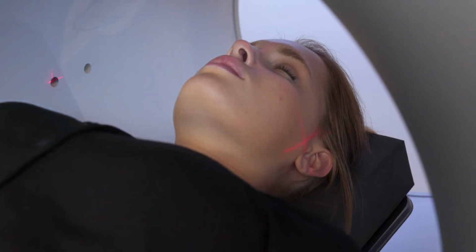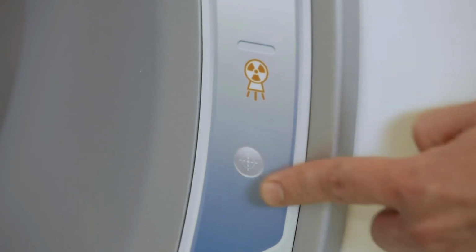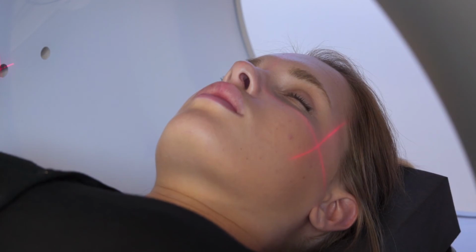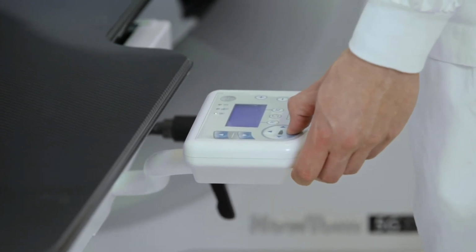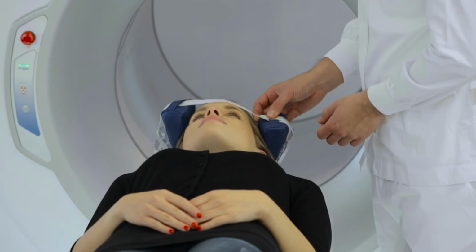In this case, it is necessary to have started the NNT software, or use the keypads on the sides of the scanning unit. Perform a fine adjustment of the patient's position using the movement control keys, up, down, left, right. If necessary, fix the anatomical part with the supplied fixing devices.